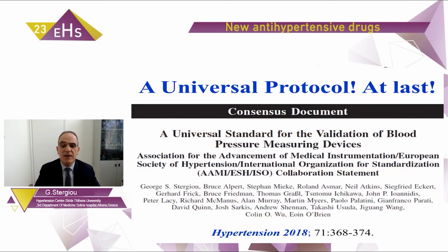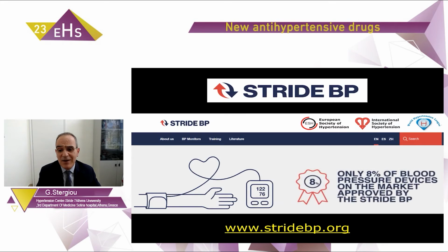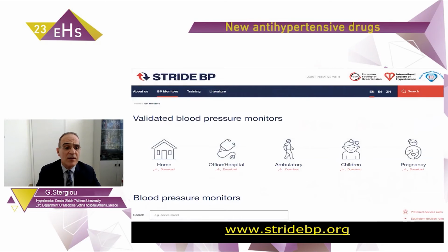It is very important that there is now a universal protocol, one protocol around the world for validating blood pressure monitors, all monitors. And if you want to find which devices on the market are validated, you should visit one of the established websites. The STRIDE-BP is supported by the European Society of Hypertension, the International Society of Hypertension, and the World Hypertension League. It is important to say here that only 8% of the blood pressure devices available on the market are approved by the STRIDE-BP. So you go to this website and you download the updated list of accurate home monitors or office monitors or ambulatory monitors, or lists for children and pregnancy. Only validated devices should be used.